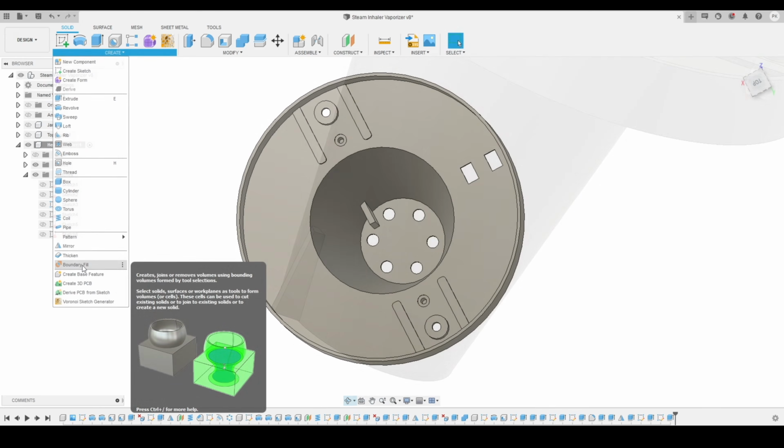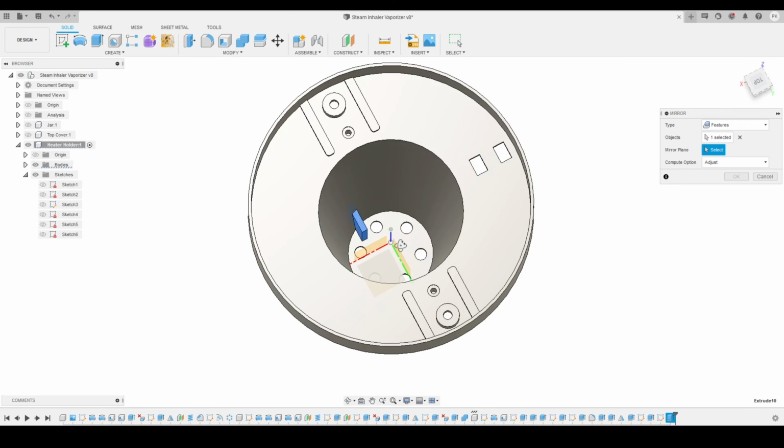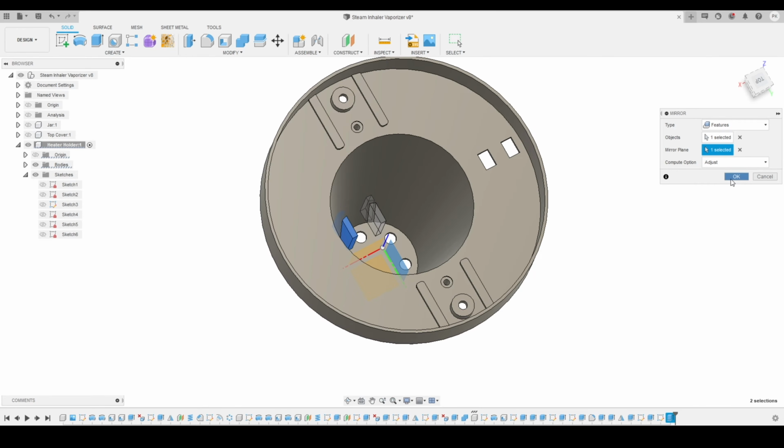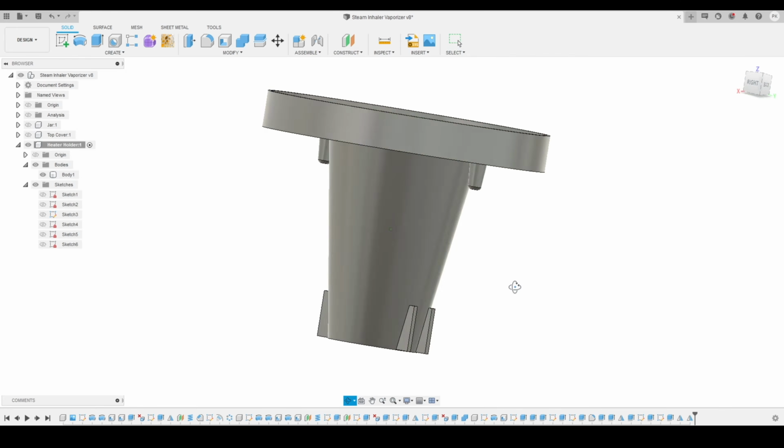Here you can see. I will first mirror this particular body, whatever rectangles we had converted to a 3D shape. We'll select that particular feature, select the mirror plane, and here you can see I will select this plane as the mirror plane, and press OK. So we had mirrored this, and now I'm going to select both the features again by activating the mirror tool, and we'll mirror them on the other side as well. We'll select both the features, then select the mirror plane. This time I'm mirroring it on the other two sides. Here you can see we got 4 wedge shapes.